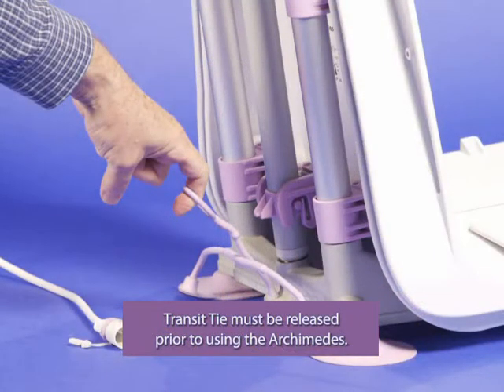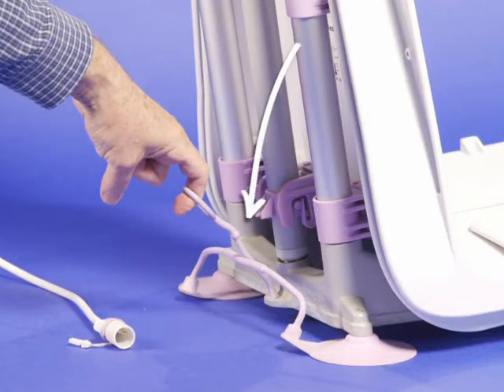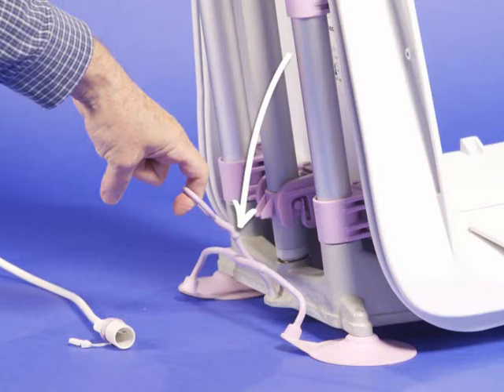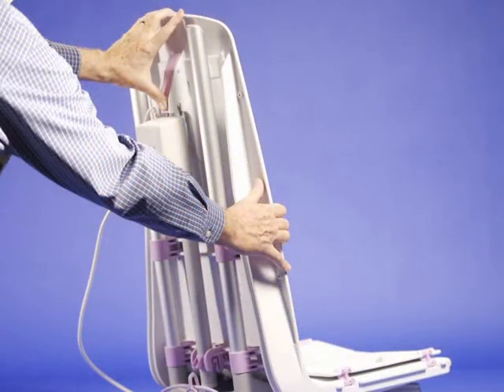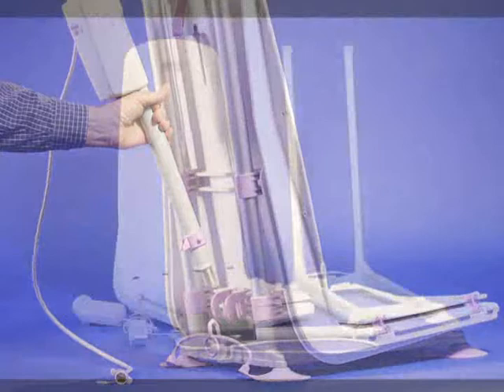The transit tie must be released prior to using the Archimedes. Pull up on the ring until the ball is clear of the slot on the back of the actuator. If you need to remove the actuator, push in on the release and pull up on the chair back at the same time. The actuator lifts out of the slot on the base of the frame.